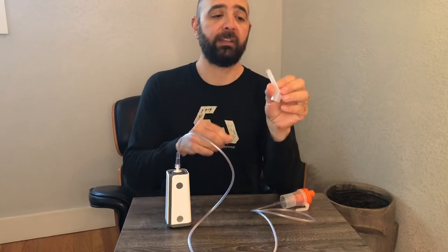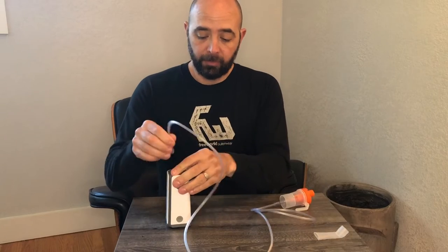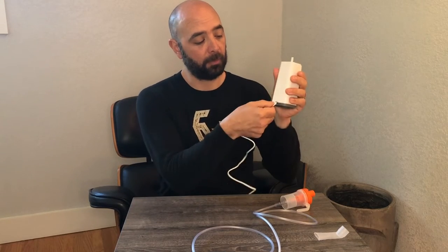I'm going to show you the mouthpiece instead. The unit itself is pretty nice — it's really clean looking. The way it's powered is via USB and USB-C. Go ahead and plug it in the back right there and then connect it to any USB port you have available.